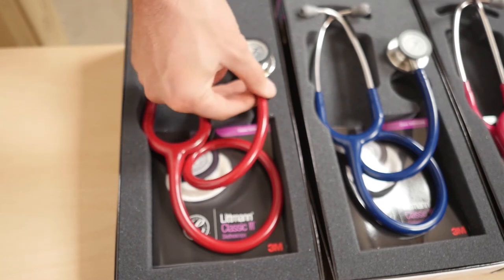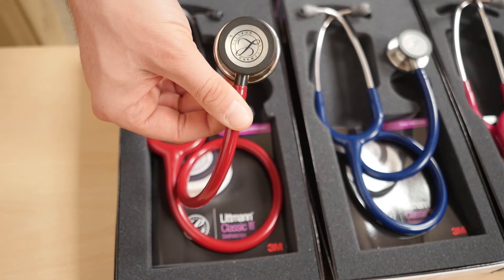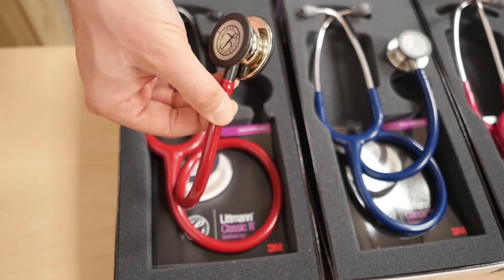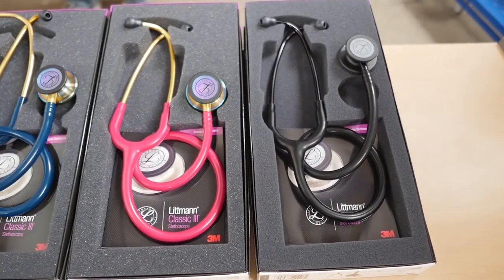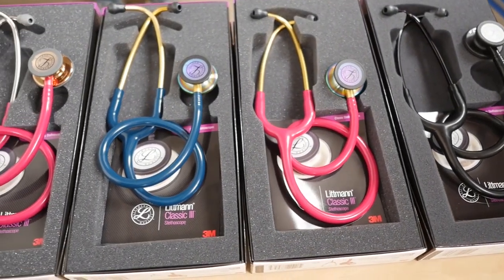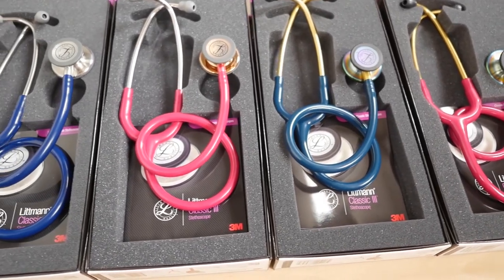3M Littmann stethoscopes are the top choice for both students and millions of dedicated medical professionals around the world. The 3M Littmann Classic III stethoscope is the model recommended for students who are looking for a high quality, reliable stethoscope for classroom and clinical practice. It offers high acoustic sensitivity, enhanced comfort and advanced features.